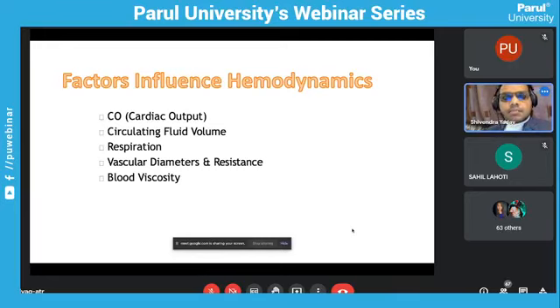If a patient is receiving any other fluids, there will be a change in the pressure waveforms because of the temperature change. Body temperature is 37 degrees Celsius, but you give saline which is kept in theaters and is cold, and sometimes a change in temperature causes variation in hemodynamic pressure recordings.